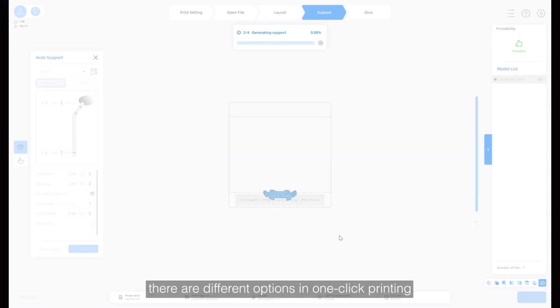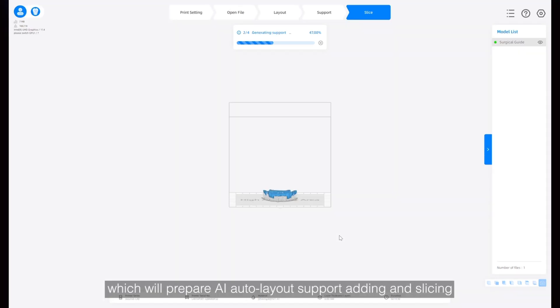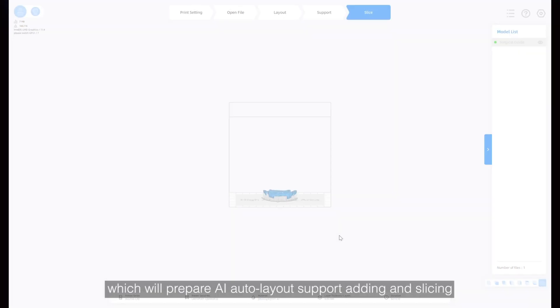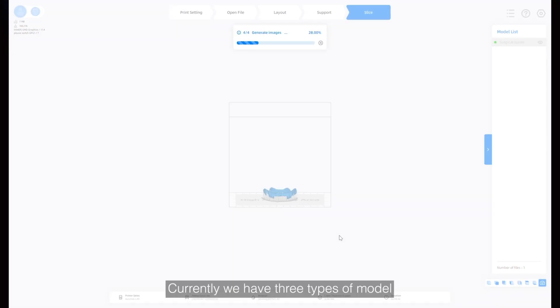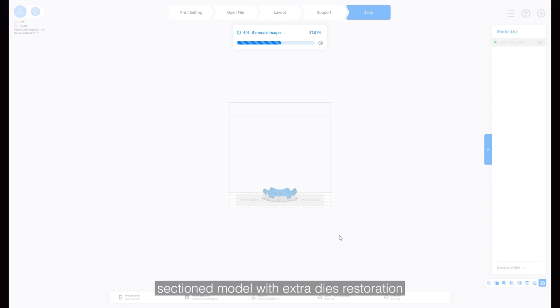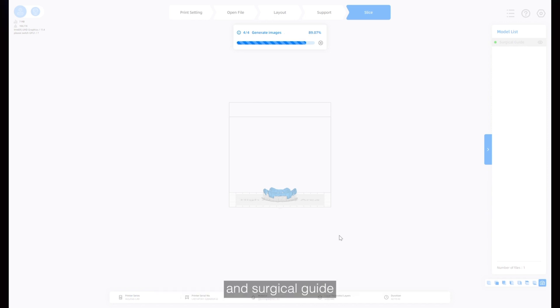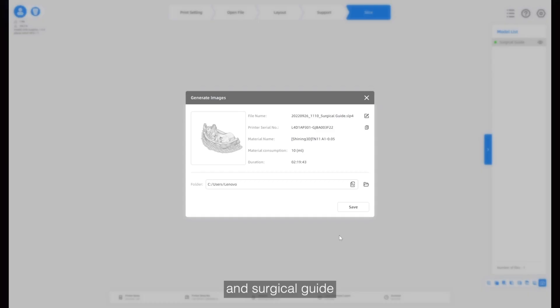Depending on different model types, there are different options in one-click printing, which will prepare AI auto layout, support adding and slicing. Currently we have three types of model: crown and bridge, section model with extra die restoration, and surgical guide.